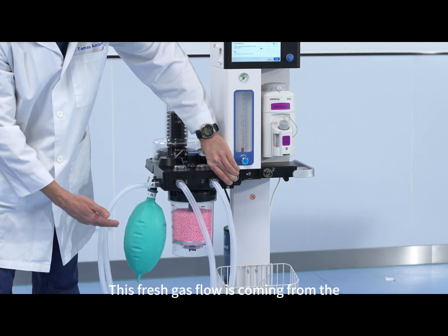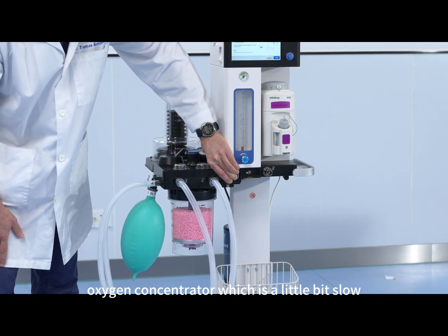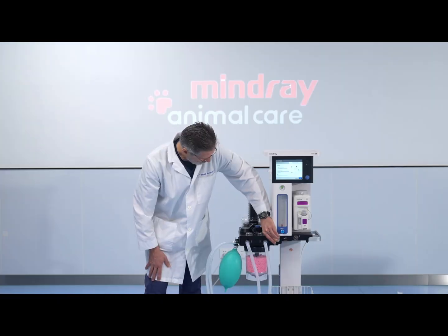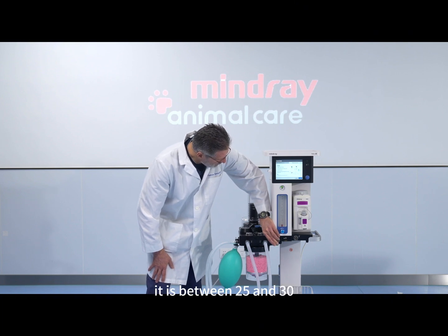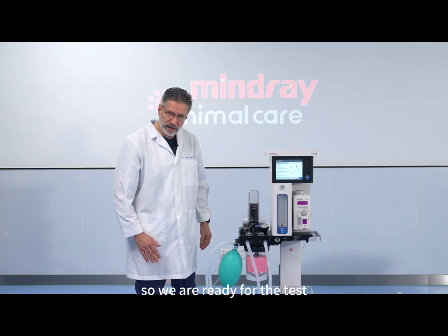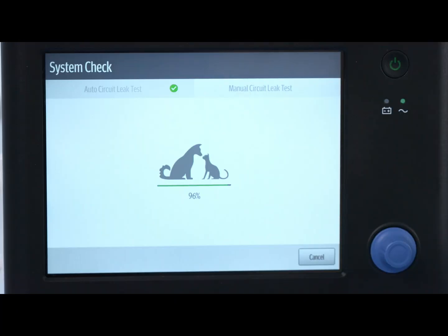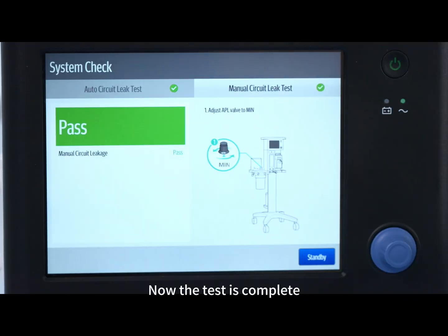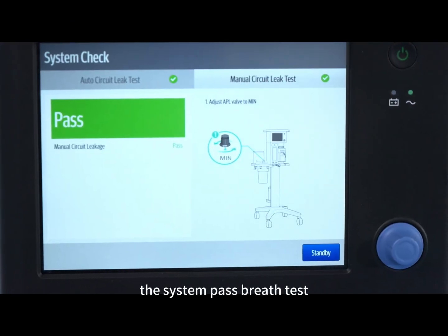This fresh gas flow is coming from the oxygen concentrator, which is a little bit slow, but that's not a problem. Pressure is raising now — it's between 25 and 30, so we are ready for the test, and I press the continue button. Now the test is complete, and as we can see, the system passed the leak test.